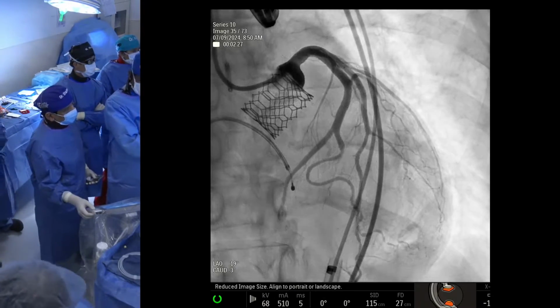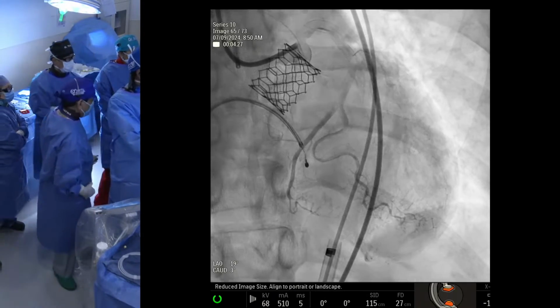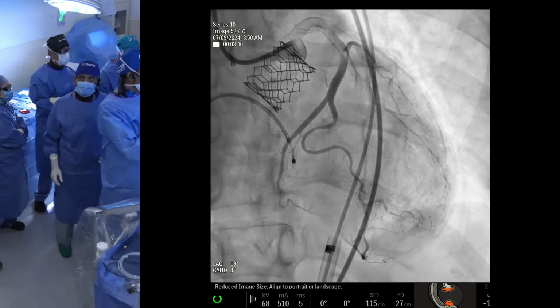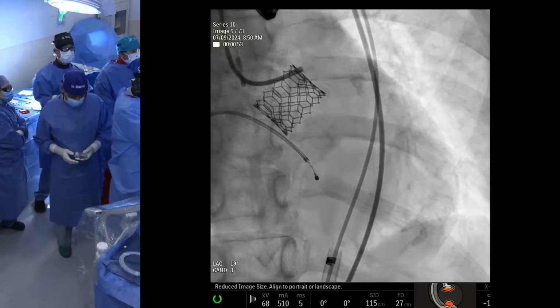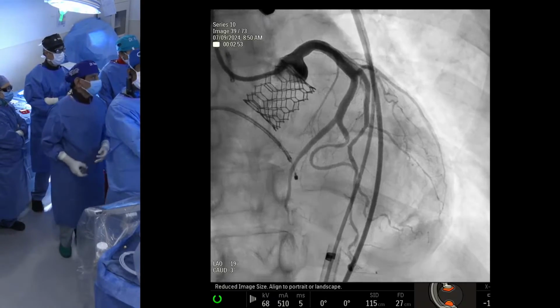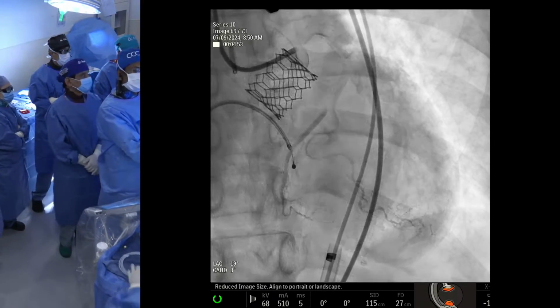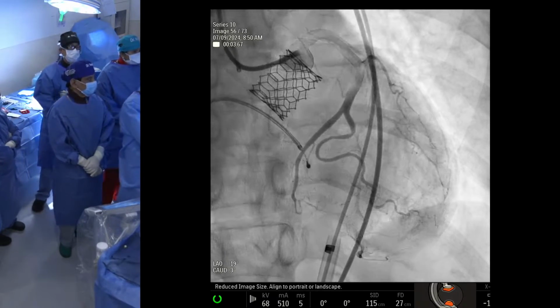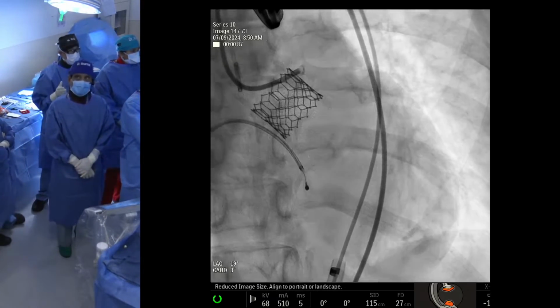So the question is, from a teaching point of view, when you want to protect the left main, do you go through the cell or above? Yes, cell. Go through the cell. Can you explain why? My worry still here is I think the bulky leaflet is the problem. See that? But we'll pre-dilate first because you need to create a favorable landing zone for your second valve.